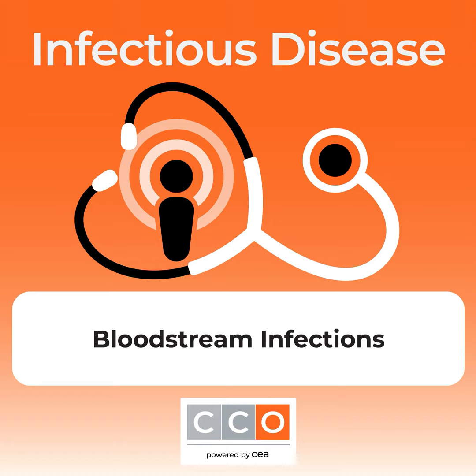Now, the T2 Biosystems emerged as the first FDA-cleared diagnostic test to identify pathogens actually directly from whole blood. And so this technology works by combining PCR technology and magnetic resonance imaging using probe-enriched superparamagnetic nanoparticles. So removing the need for blood cultures can actually really decrease the time for the results. But of course, with a test like this, you really want to have really high pre-test probability that a patient has bacteremia to steward the utilization of this test.